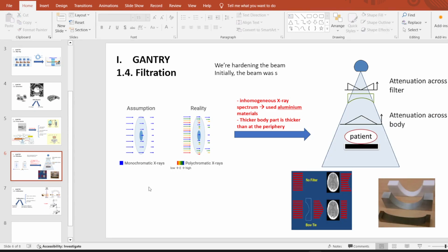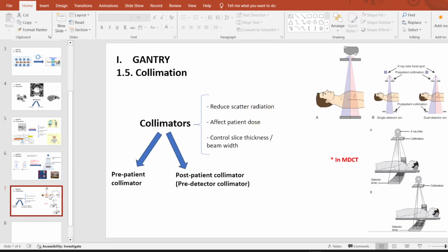So that's it. Let's go to the last part of this session, my friend. Collimation. What a collimation! I remember the time I pronounced it wrongly in my first videos. Really, I apologize. This time it's different: collimator. All right. What is a collimator?